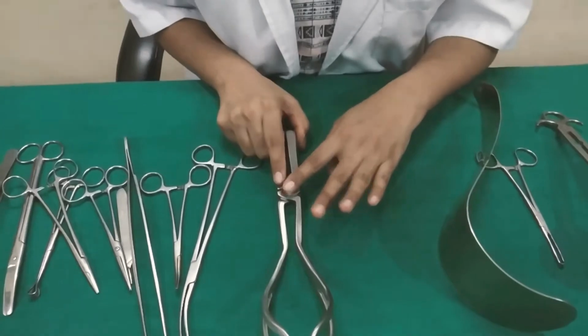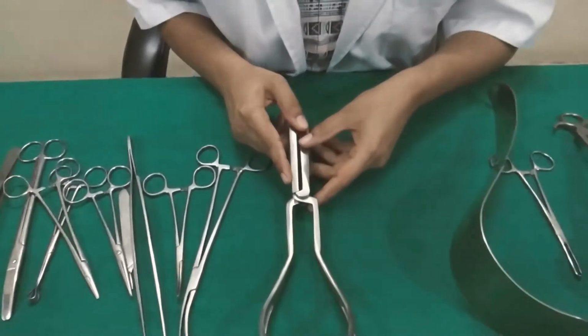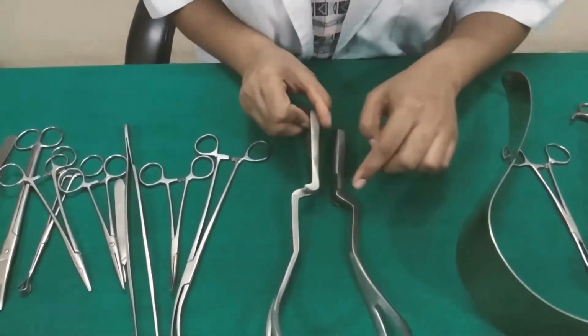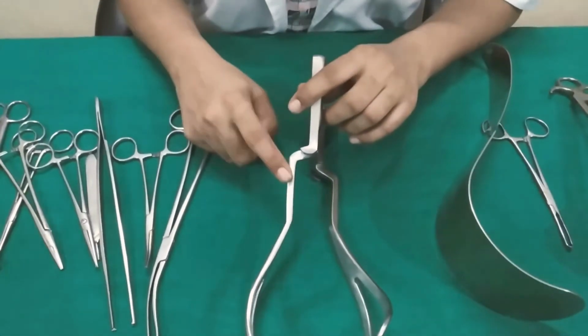First of all, an episiotomy should be given, and local infiltration has to be given. Then identify the left and right blades. Then locking. We usually apply the left blade first; the left blade we insert first.